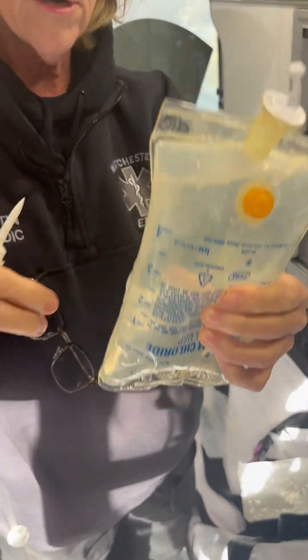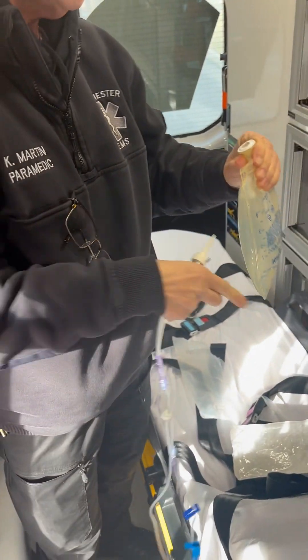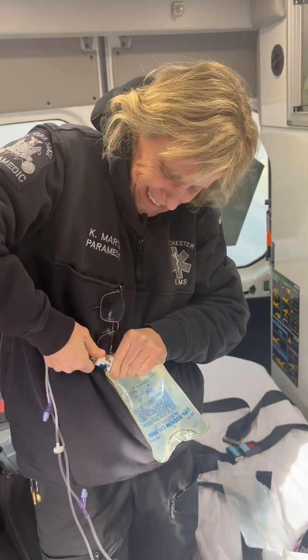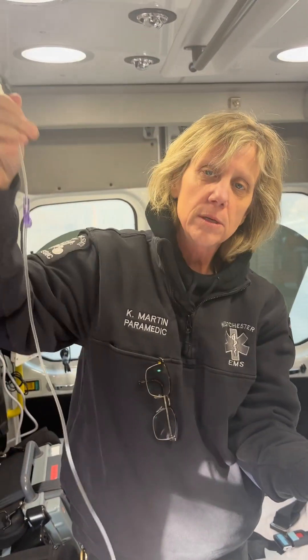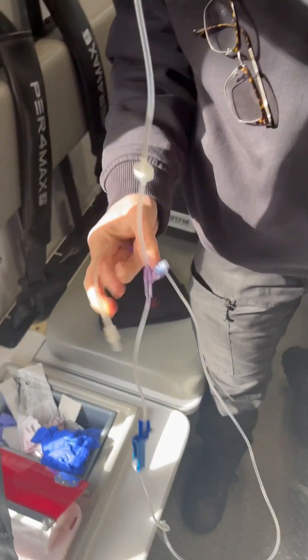You're going to turn the bag upside down and pull this little tab off here carefully. There's a hole right there — you're going to put the spike in there like this. Then I'm going to put it down and open this up. It's locked right here — this pinches the hose shut. So we're going to open that up.